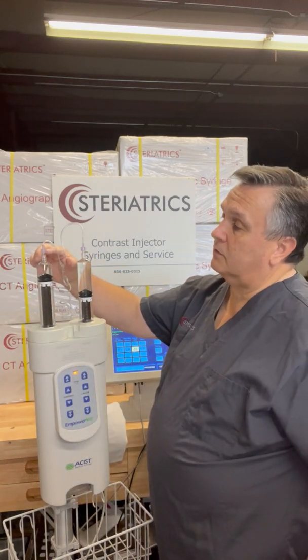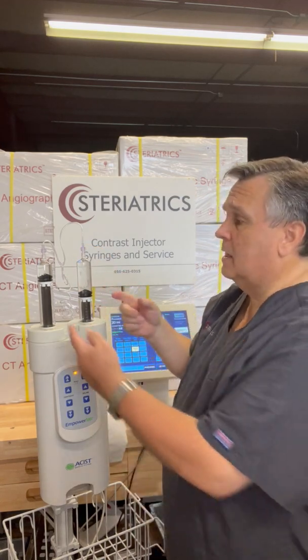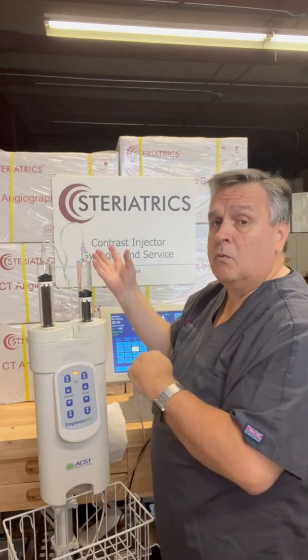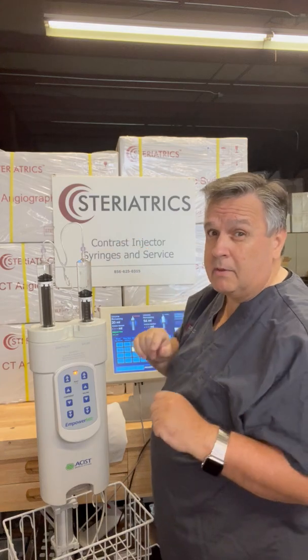There are one-way reflux valves built into each one of these connectors. What that means is that contrast is not going to flow into saline and vice versa. But when you go to get done injecting, it's not going to let you draw air in either. So remember that for later.